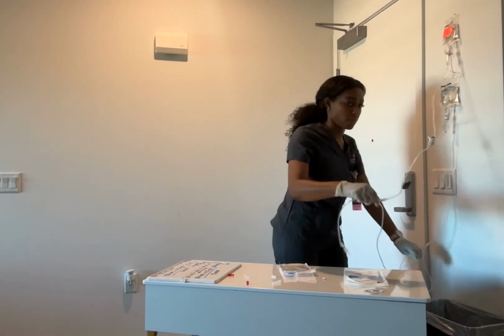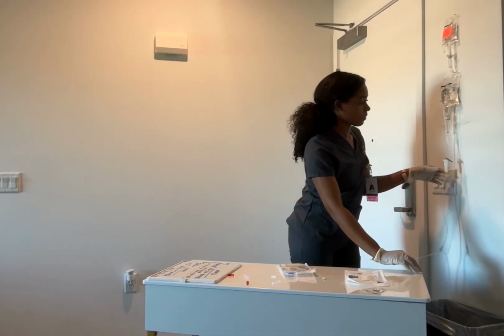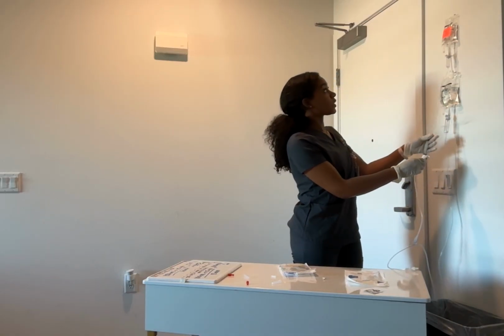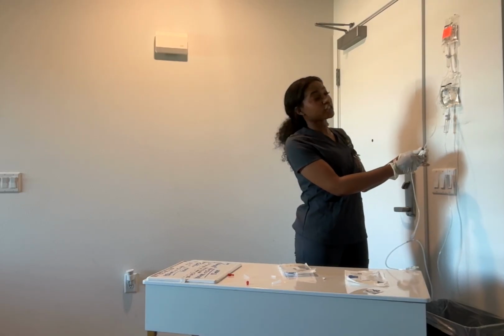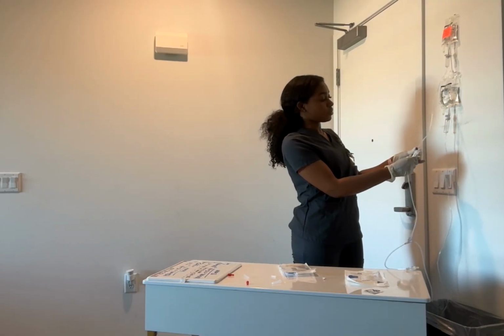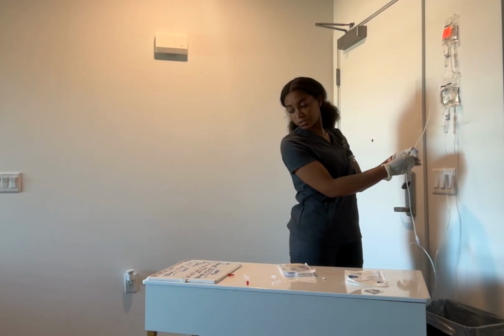And we're going to make sure that the amoxicillin is at 100 drops per minute. Double checking the healthcare provider's order. And I'm just going to verbally say that it is and not do the timing like I did with the nasal saline.